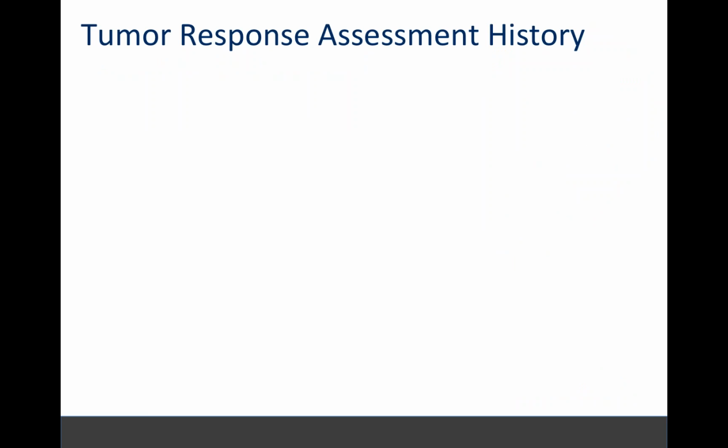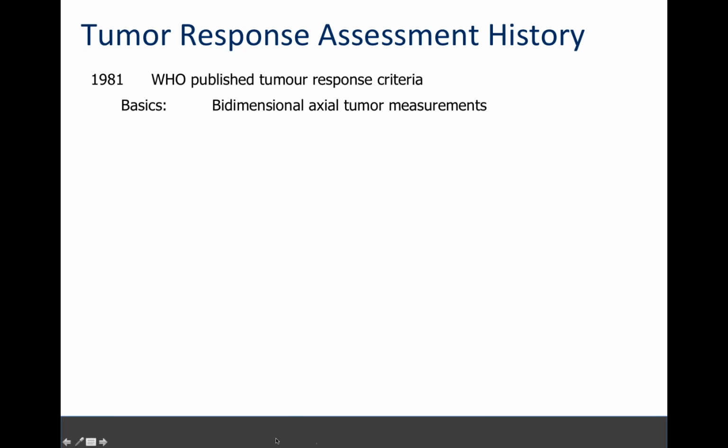So with that, I will turn it over to Andrew, who can walk us through a little bit of history on tumor response assessment. Sure, appreciate the introduction. Thanks so much, Tim. So we're going to talk about tumor response assessment history here, and we're kind of taking it back to the beginning.